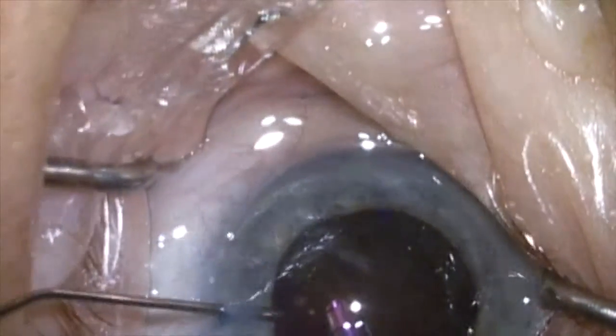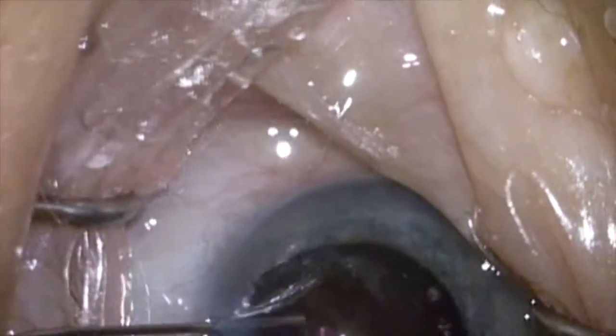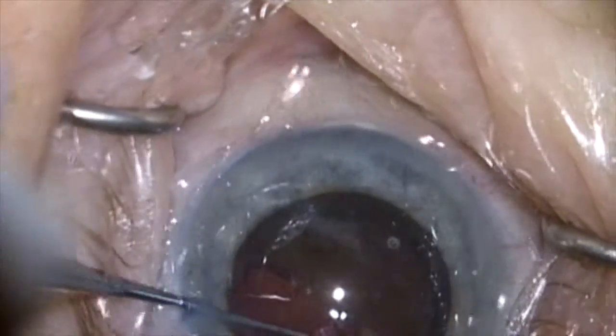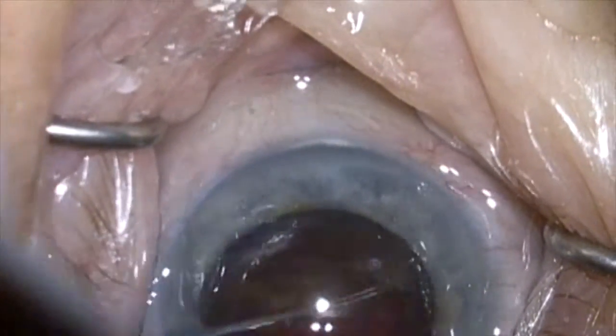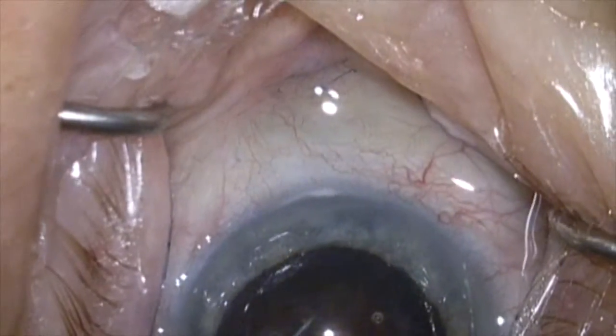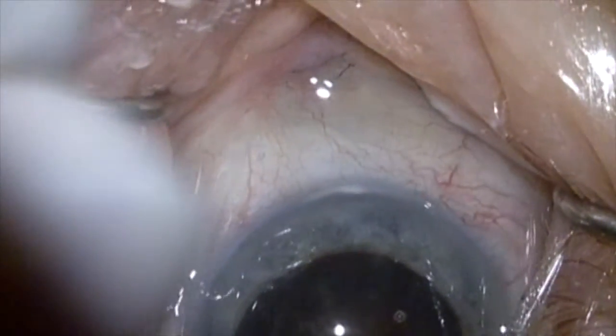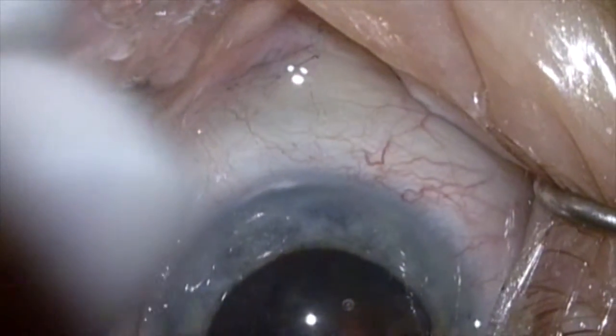Now I'm down to half the lens. I'm going to add more dispersive viscoelastic to push the posterior capsule back and to protect the cornea. We'll now crack this half into another half, tear that quadrant off — and again you can see how leathery things are here.